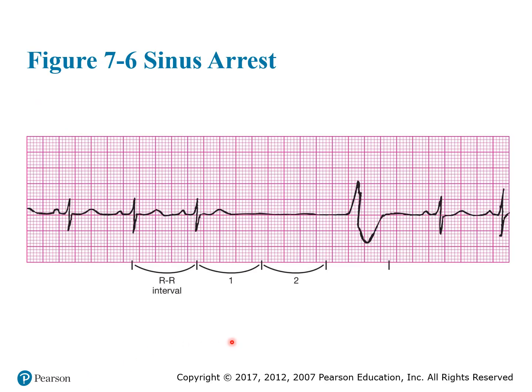And here's what it's going to look like. If you're in the room with your patient and this is the first time you've ever seen it, it may be a little unsettling to see this, because the heart is going to be just putting along like normal, beep, beep, beep, and then stops. So what's happening here? So we have a normal sinus rhythm, right? We're going along like we should. Sinus beat, sinus beat, sinus beat. Up until this point here, everything is good. The heart's beating like it's supposed to.